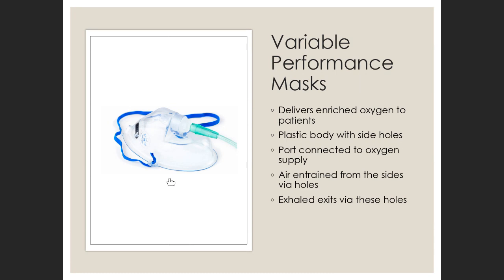Right, so yeah, these are just ordinary face masks. Oxygen comes in here, it's fitted onto the patient's face. There are perforations in it, so air is entering from outside as well. And on exhale, air goes out through these, and you get about an FiO2 of 0.4.